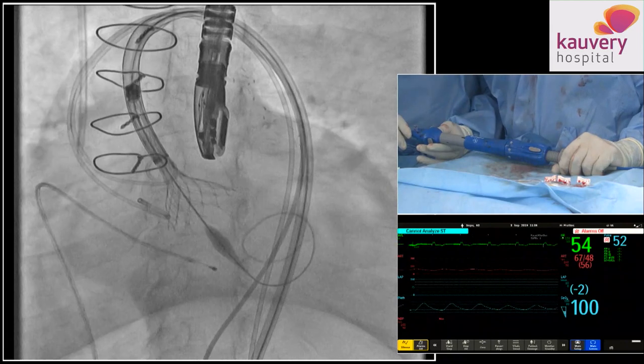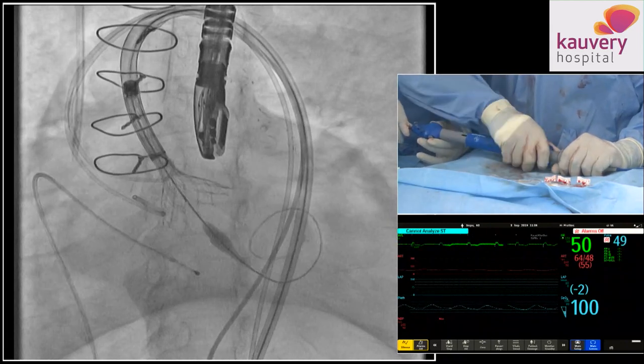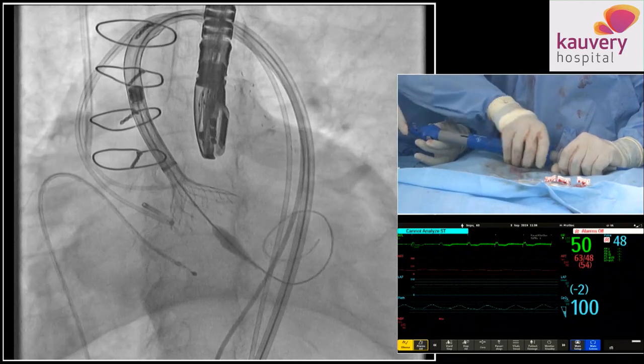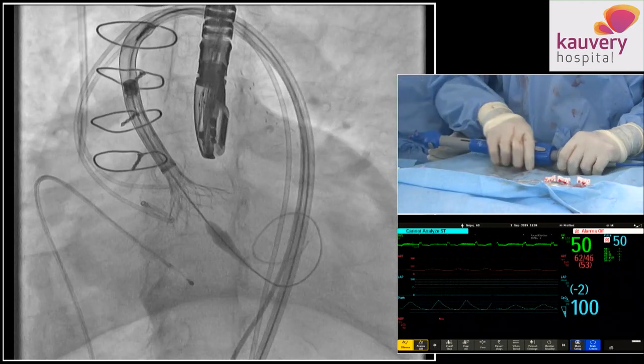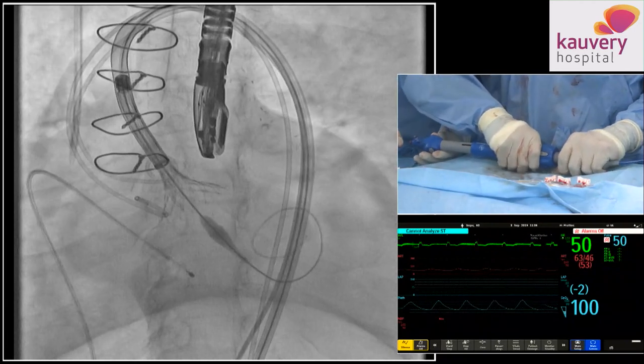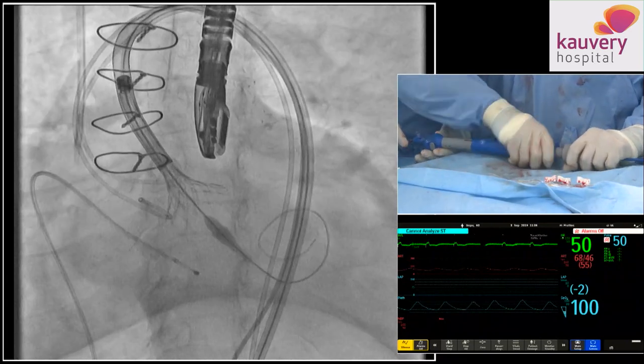It's too much tension. No, don't worry. Push the wire a little bit. Anand Raman, push the wire. Just capture. By capturing, we will release the tension. One second. Okay, now start releasing. BP is low. No, don't push. Just start releasing.